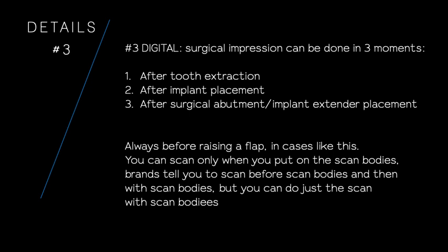bodies. But it doesn't matter when you do it, if it is in one of these 3 moments, you should keep in mind that you should always do it before raising a flap. Before raising a flap in cases like this, okay? Because otherwise you'll get lots of trouble with the blood and everything. You'll get lots of trouble being able to scan the scan bodies.